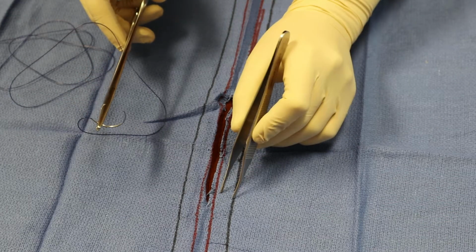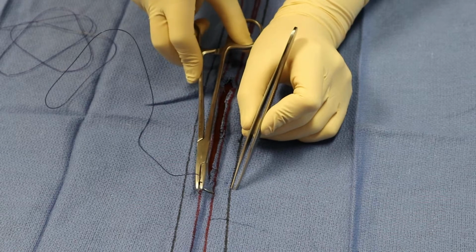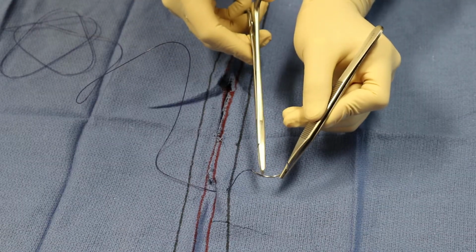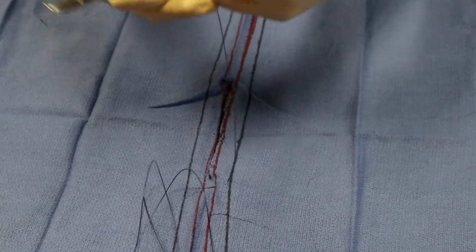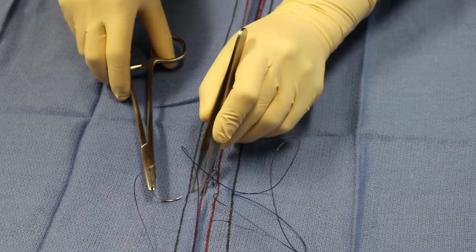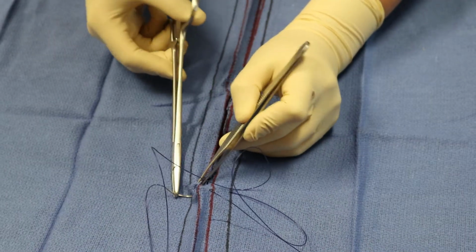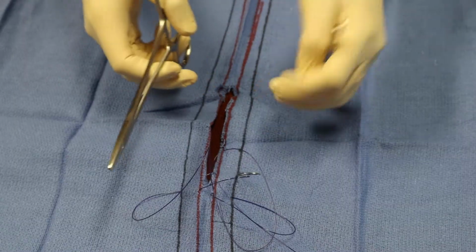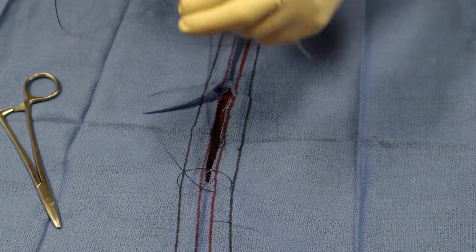So to start them like a Lembert, remember you're going to go just past your incision site, and you're going to go near to far or deep to superficial. So that's going to be the red line to the blue line, black line. And then you'll take a bite that's directly across from it on the opposite side from the black line to the red line. So that's the far line to the near line. And remember that the needle end and the free suture end are going to want to point down through your incision so that when you tie them, they don't go over the top of that loop.